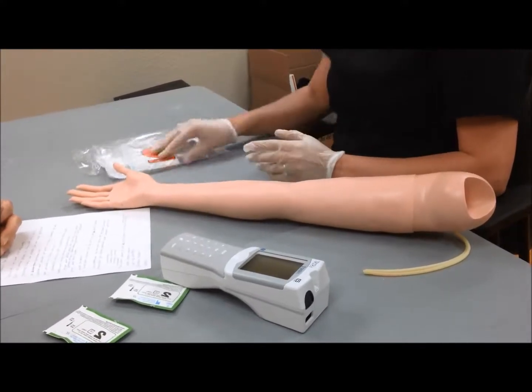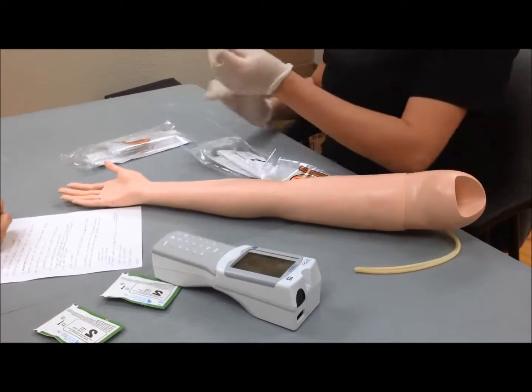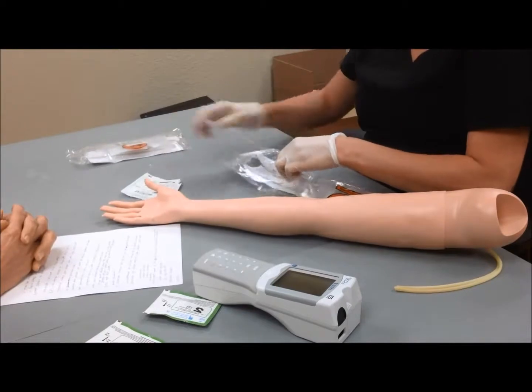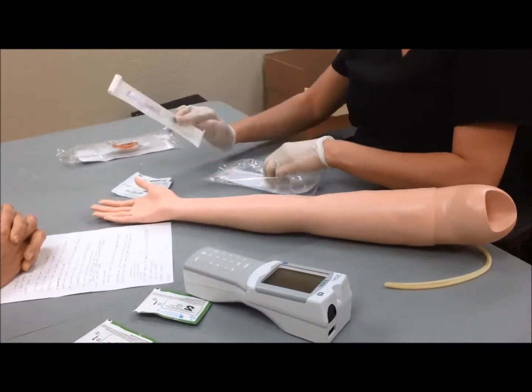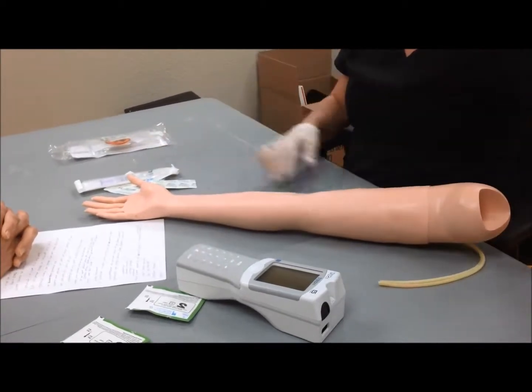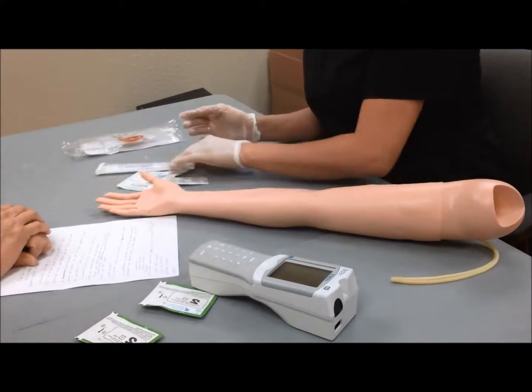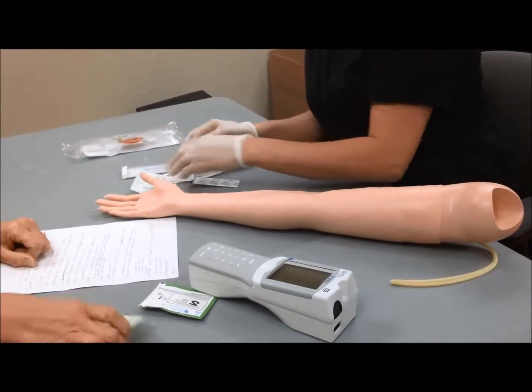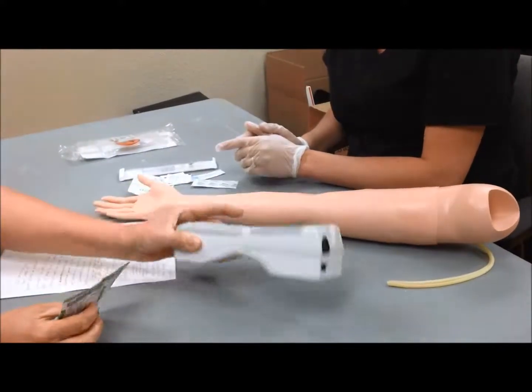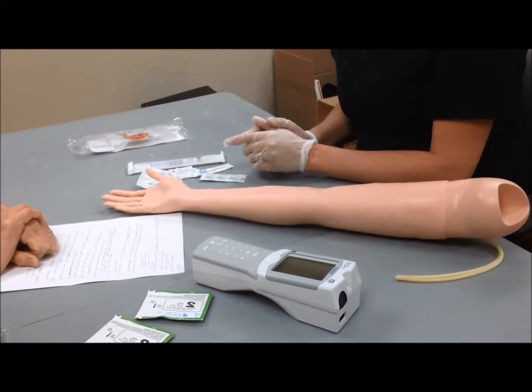Let's open an ABG kit and see what it contains. Have your gauze, alcohol swabs, your syringe, which has heparin in it, Band-Aids, and a bag. You also need several cartridges for the calibrating iStat machine. They're refrigerated, so you need to keep them out for several minutes to warm them up.